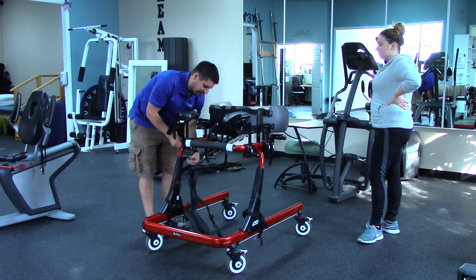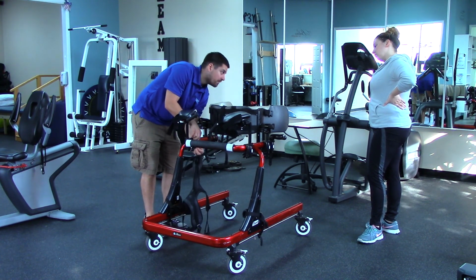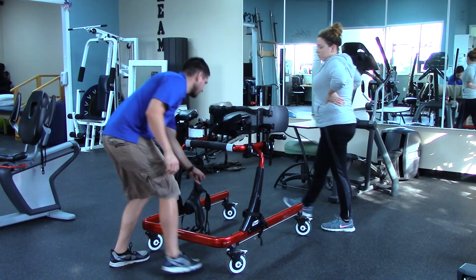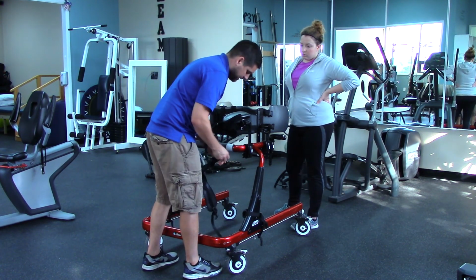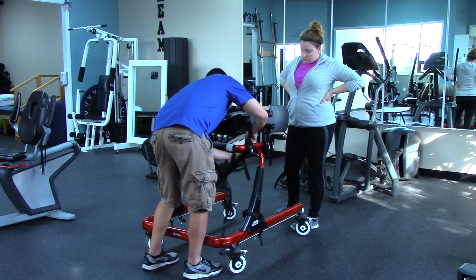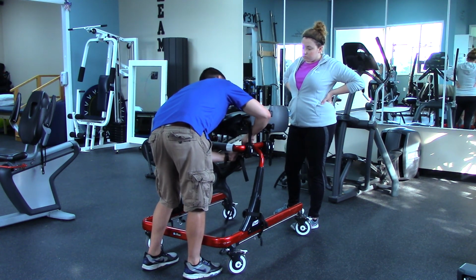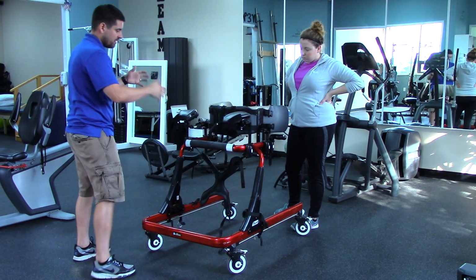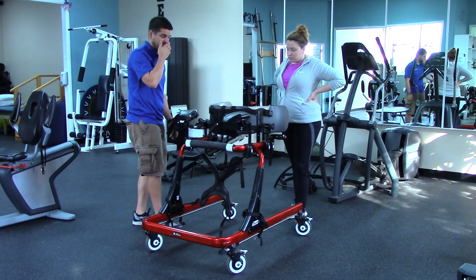For anybody that really doesn't have the ability or might be heavier, the Pacer, or the Tram, is going to be your better bet. However, the reason that I get my dependent guy in here is because of the support that it offers. I have a lot more freedom with this to get it working the way that I want.